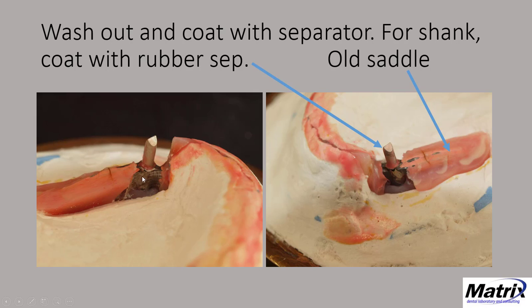Okay. You'll also notice that I have some e-glass fiber that I placed down in this area. I'm a big believer in polyaramid fibers, and I wanted to make sure that I reinforce the acrylic between the acrylic that's new and old. So I just put a little bit of that product in there. You could use Stick Tech from GC. There's several out there. This was just some e-glass I had laying around, so I laid it in there. It's silanated, which helps it bond to the acrylic. Place that in there. And this is the other side.